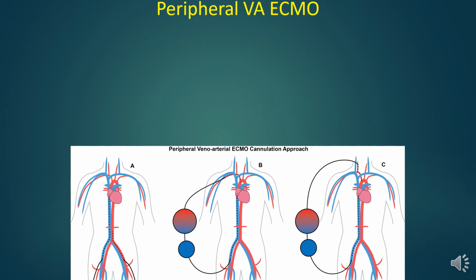Patients who are both hypoxic and hypotensive deserve additional consideration, specifically hypoxic patients with mild hypotension and a low-dose vasopressor requirement in the setting of previously normal heart function, who will likely require VV rather than VA ECMO. Correction of the hypoxia with VV ECMO often resolves the hypotension as well.